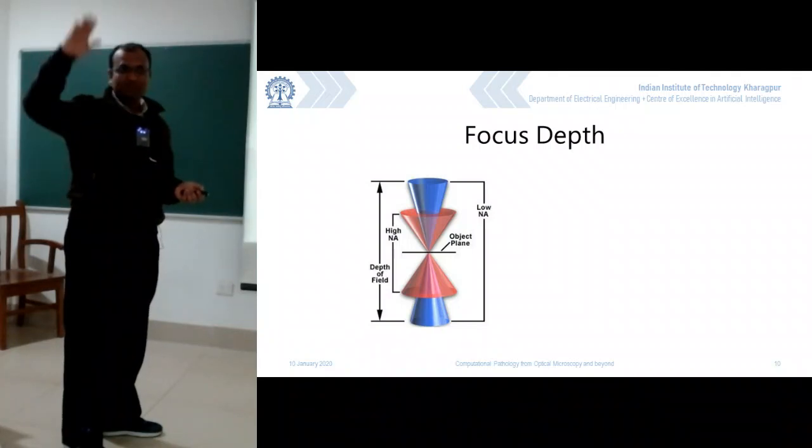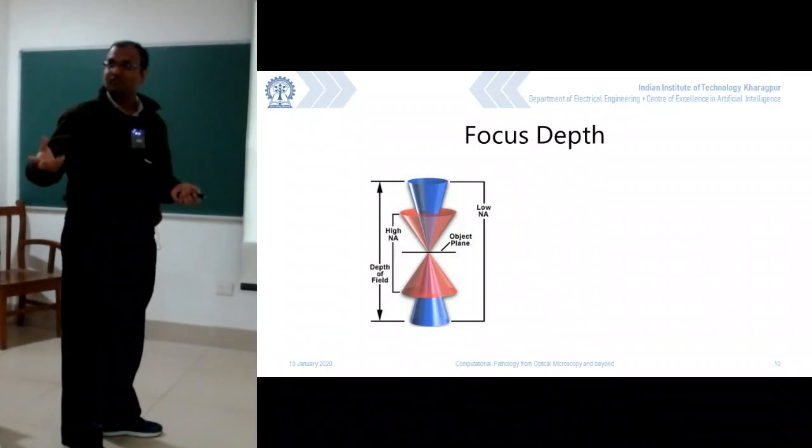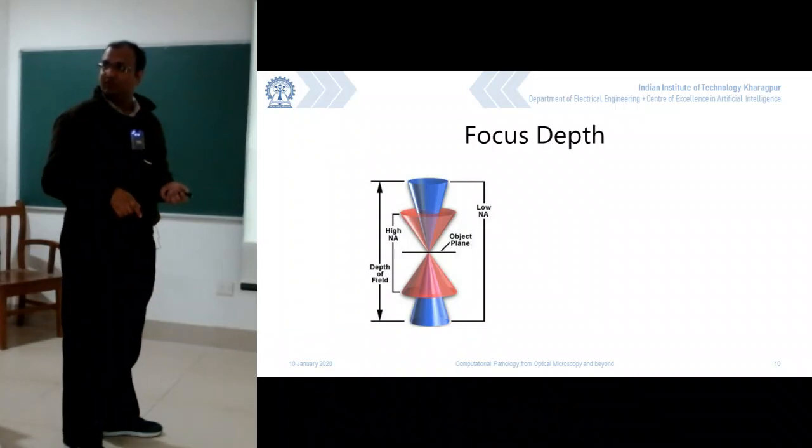It will always appear as if the whole image is in focus because your sensor is not able to resolve anything any further. If I had an infinity resolution sensor, I could have gone down to a point which is tending towards 0. Otherwise, I will always have this finite amount of resolution challenge which will still keep on coming over here.